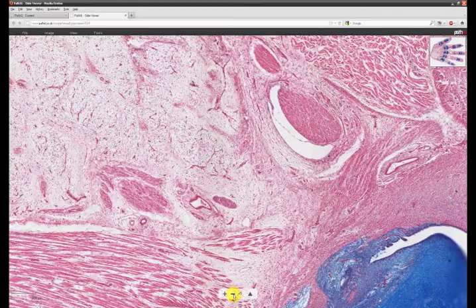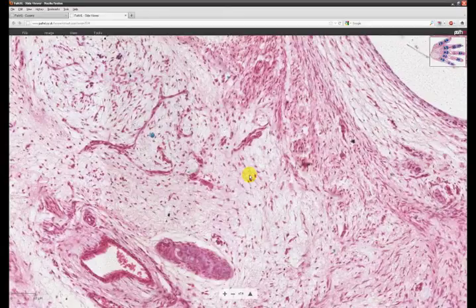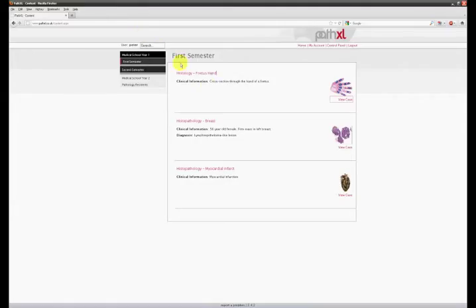In addition to selecting specific objective magnifications, you can step incrementally through the magnification controls using the plus or minus keys, or alternatively use the scroll wheel on the mouse to move up and down magnifications. This presents a really convenient approach to viewing and assessing digital slides.